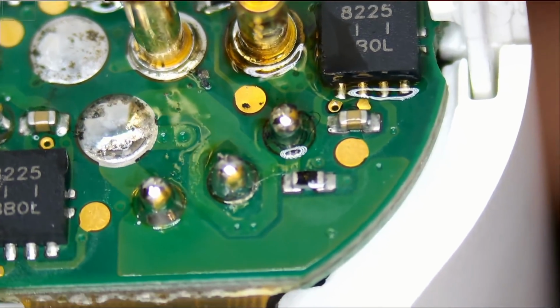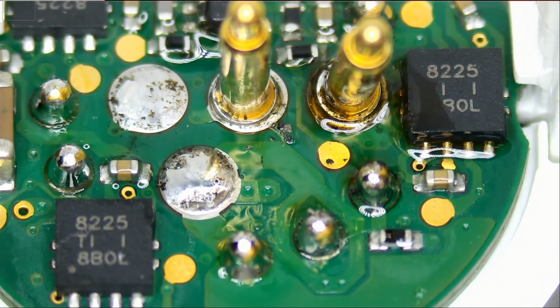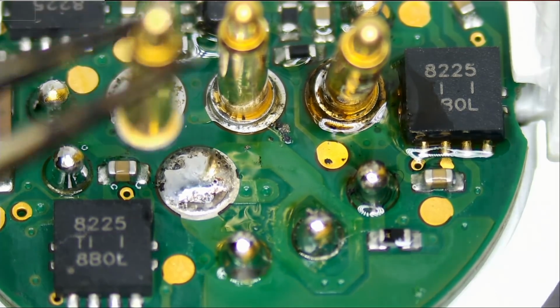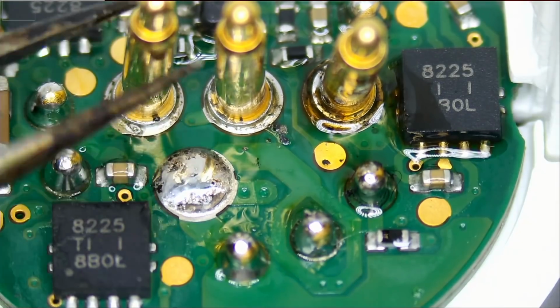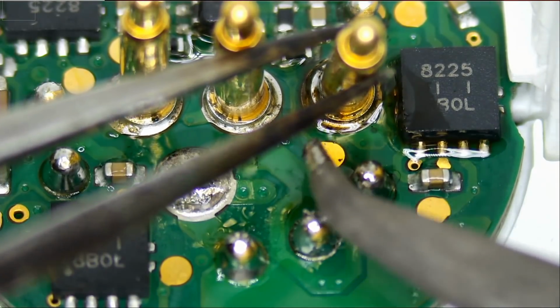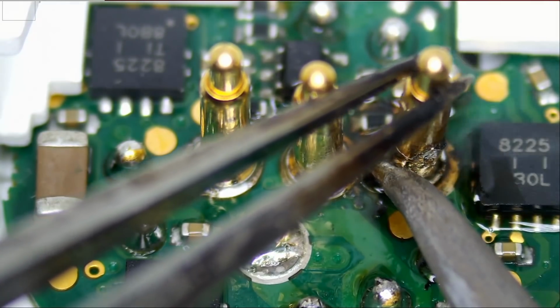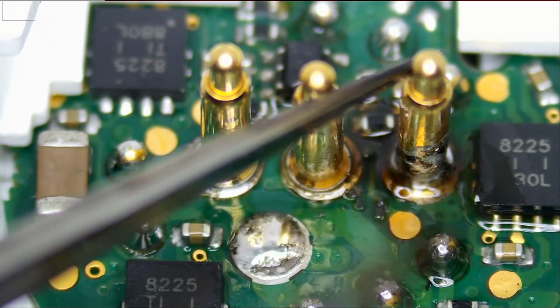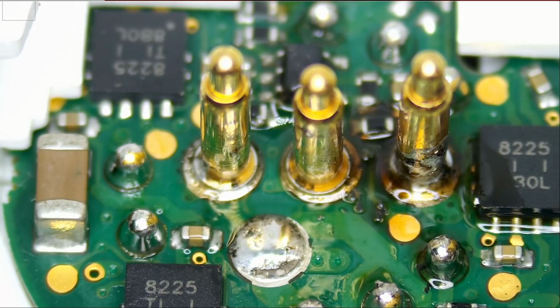Now for this one we may have to tilt that tool clockwise like this. I mean, it's not a difficult job, but it's awkward. And I really feel like I'm doing a surgery here. Okay. And I feel like this one is a little bit bent. Am I wrong? Because we cannot tell if it's vertical or not. And finally, we're gonna do the bottom one. I do not really know what those pins are for, but they could be pins for the battery.